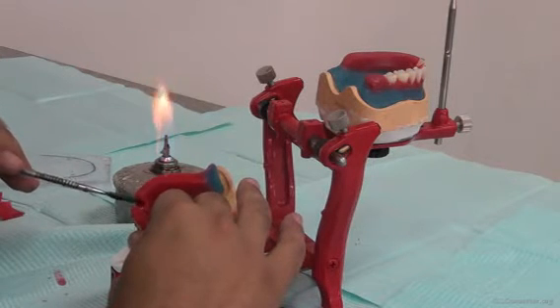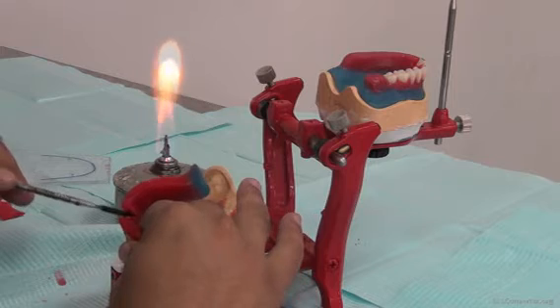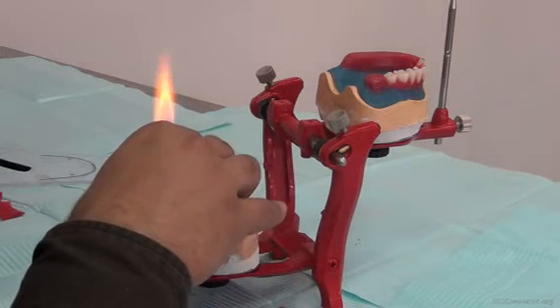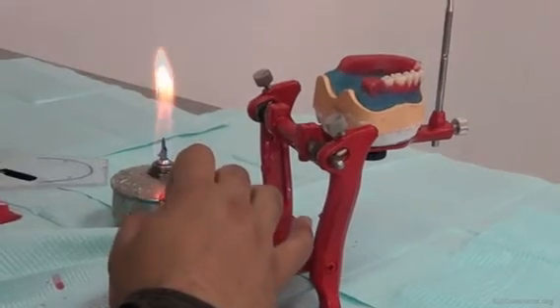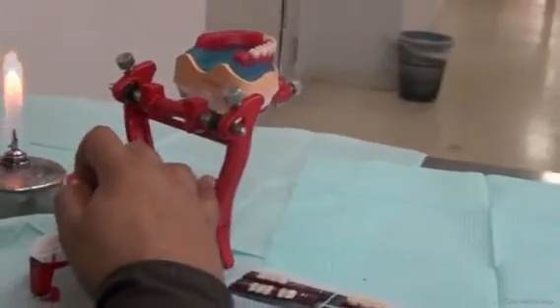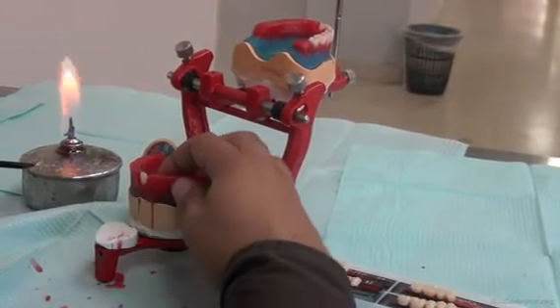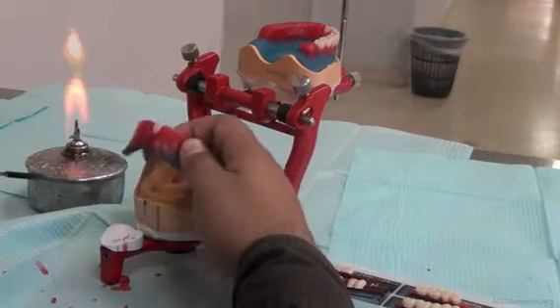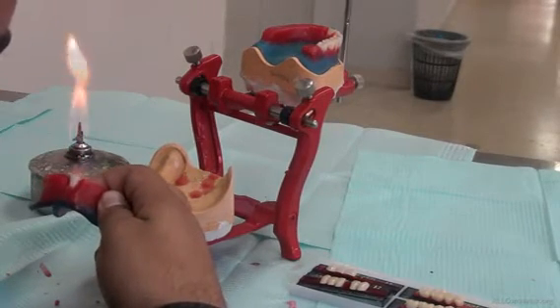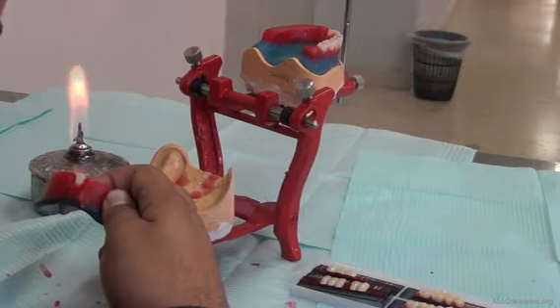So after opening the box, we make sure we do not remove too much wax. We melt down the area beneath the tooth, and then we place the tooth in its position. We're going to place the tooth 1 to 2 millimeters above the occlusal table on the wax rim. The reason for this is that we're going to create what we call an overbite. So what is an overbite? It's having the lower teeth bite in a higher position than the incisal edges of the upper teeth. So they are biting from the inside surface.